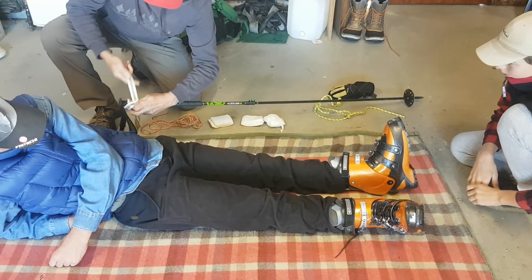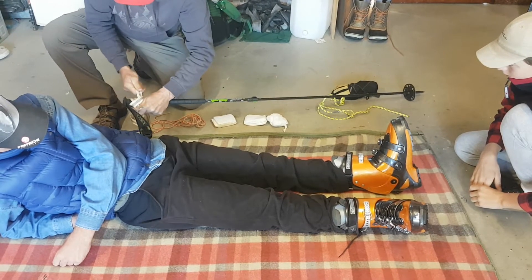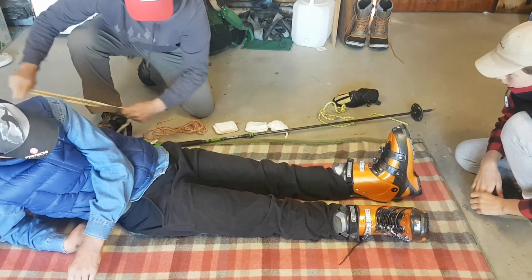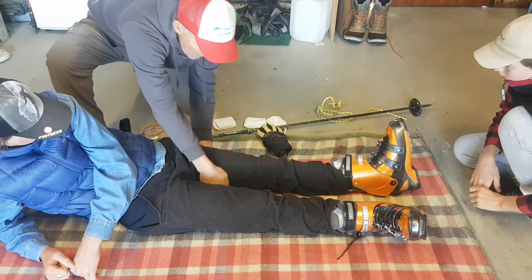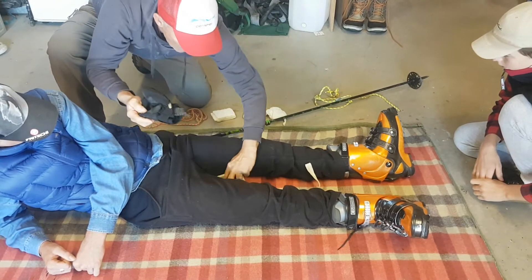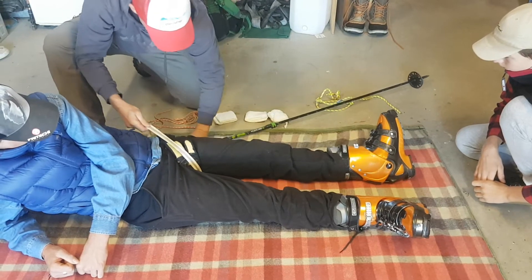We're going to adjust the top of the ski pole, tie a clove hitch, and put this around the patient's upper leg, around his groin. You have to be very careful here — it's a very painful injury. Splinting helps reduce blood loss, and it definitely helps as an analgesic, so it'll help with the pain.